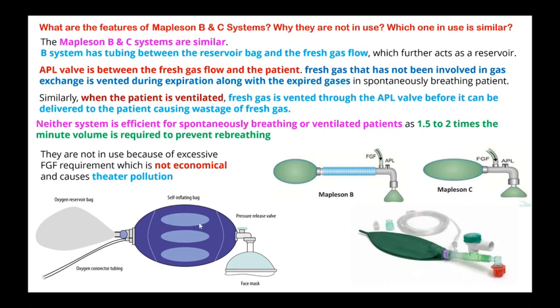What will you be delivering? Will you be giving excess oxygen or only room air? Only room air. If you don't have an oxygen line or a reservoir bag attached to your Ambu bag, you will be resuscitating the patient only with room air, because this will automatically suck in the atmospheric air and refill. This is called a self-re-inflating bag or self-inflating bag.